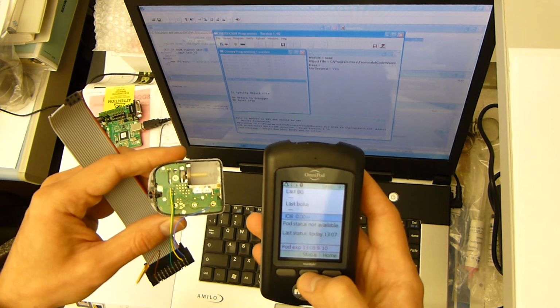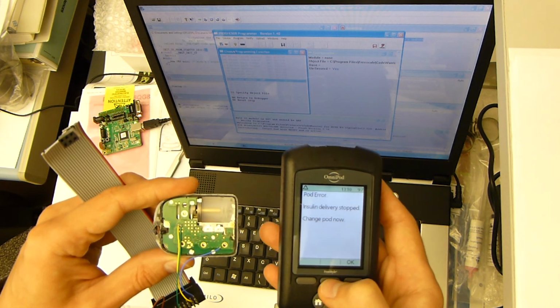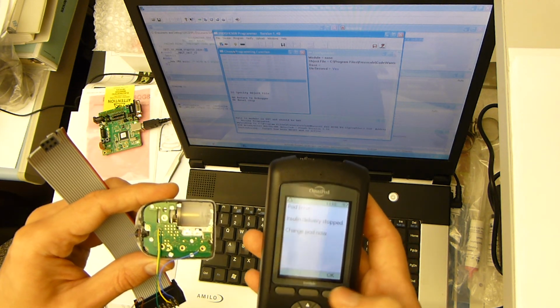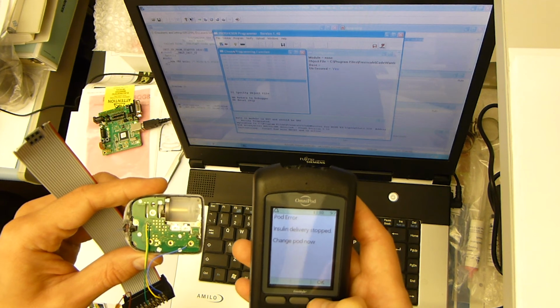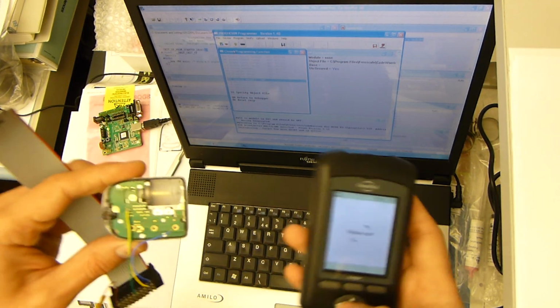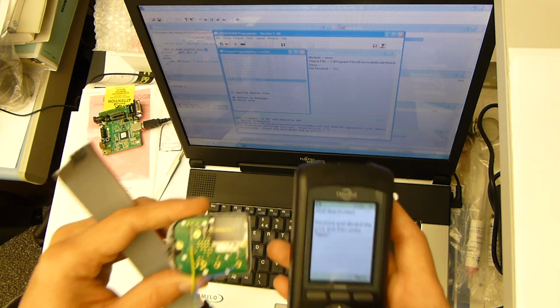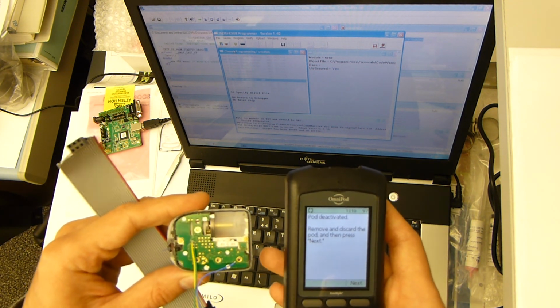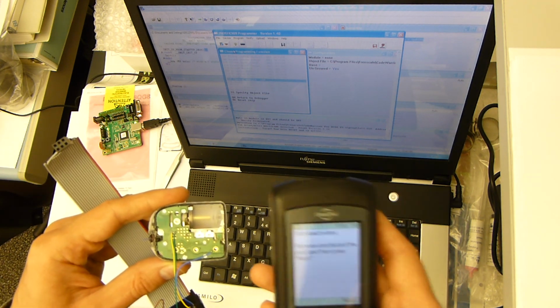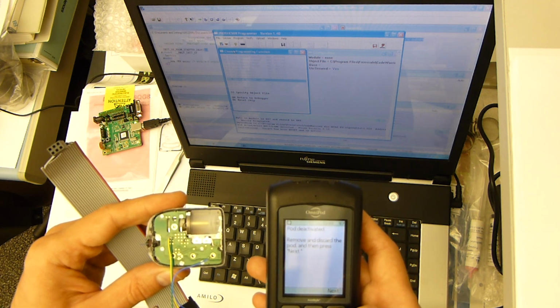And you see the PDM controller tells us that there's an error with the pod, insulin delivery stopped. So we need to deactivate the pod and either reprogram it or use a new one. So now it's stopped beeping, the pod is deactivated, and we can no longer use it, but we can reflash the firmware and test it again.